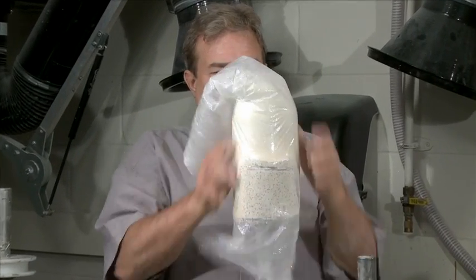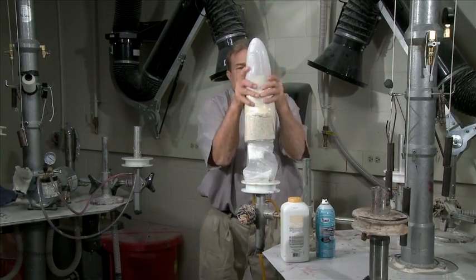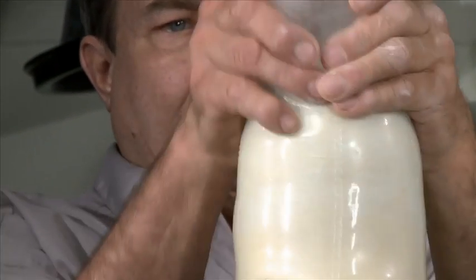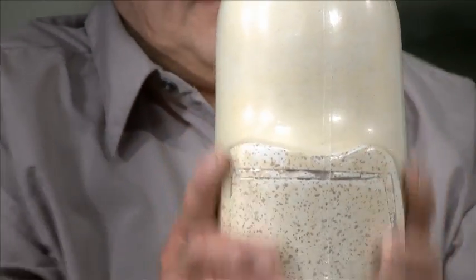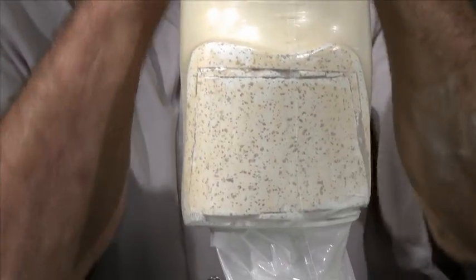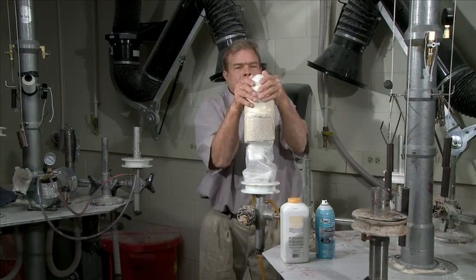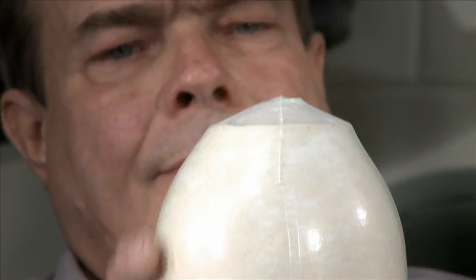Pull the bag over your model. We recommend aligning the seam to posterior. Because the SPT bag is closed-ended, you'll be able to use trapped air to more easily float the bag.